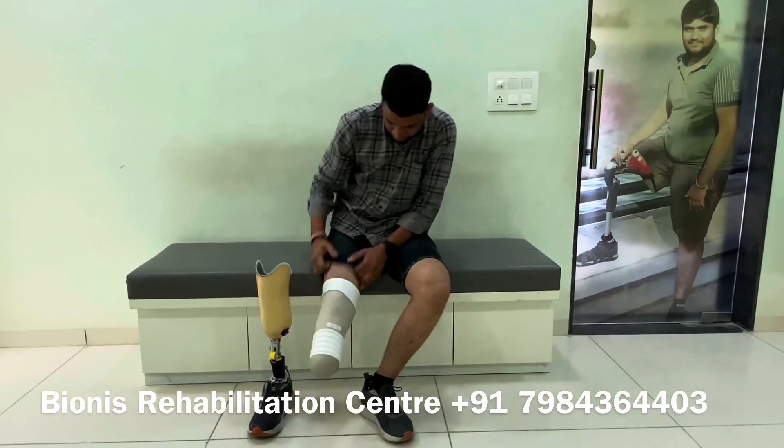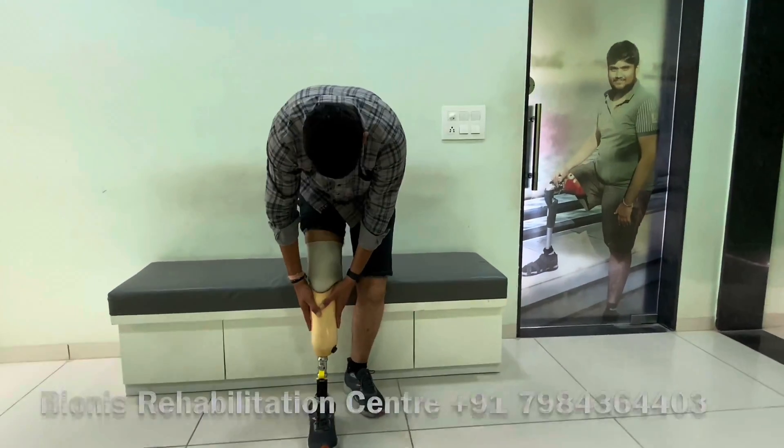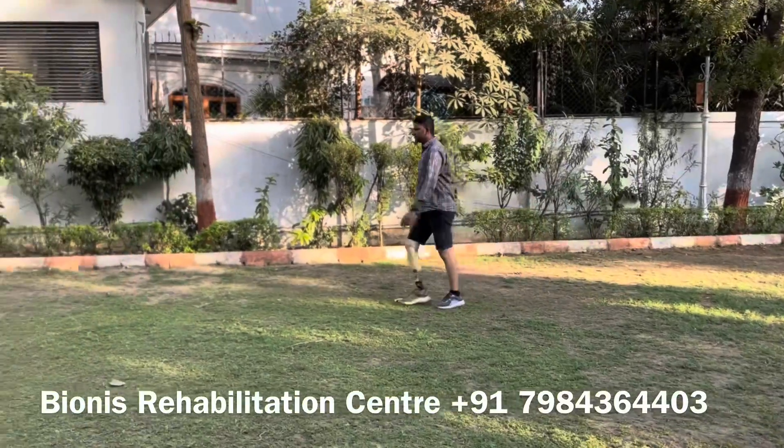Here you can see how easily he is turning the silicone liner inside out and making a smooth curve, then rolling the liner up on the rest of the limb. One may require lubricant spray in some cases, but most of the time it is not necessary to use.